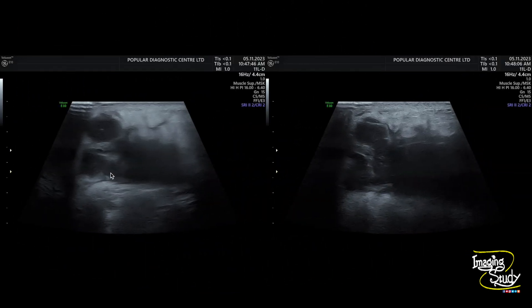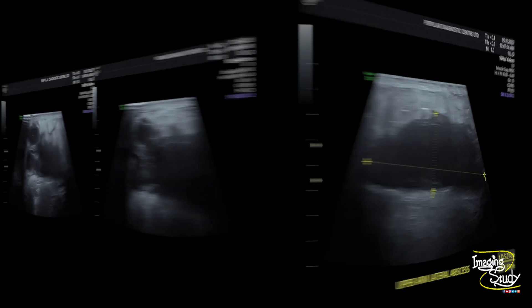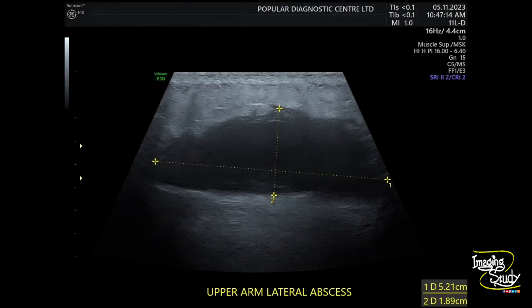Here is a picture. You can see the irregularity of the subcutaneous tissue along with the heterogeneous collection. With an approximate measurement, it is around 5.2 cm by 1.9 cm. You can also see surrounding fat plane irregularity.